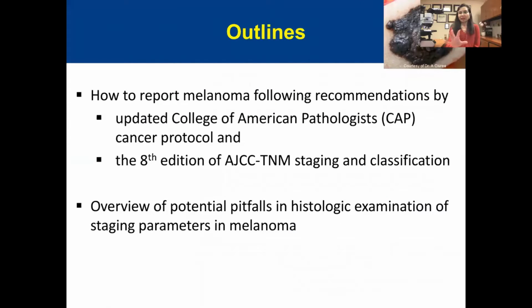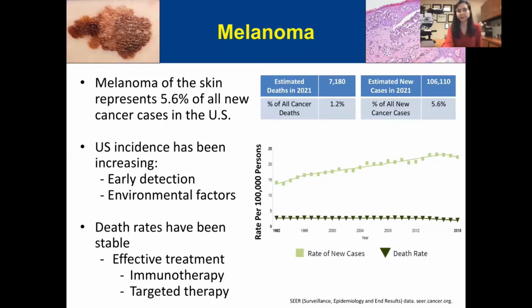So this is the outline, as I mentioned before: how to report melanoma following the recommendations of the updated CAP cancer protocol and the AJCC TNM staging and classification. I will also go over some of the potential pitfalls in histopathologic examination of staging parameters in melanoma.